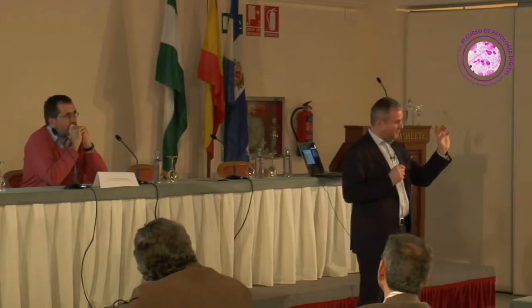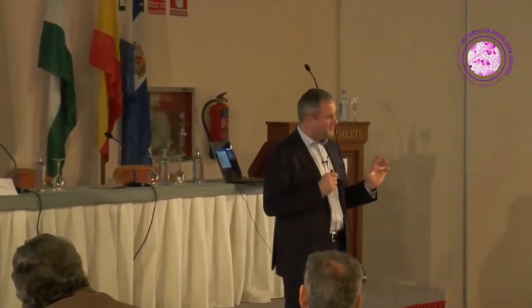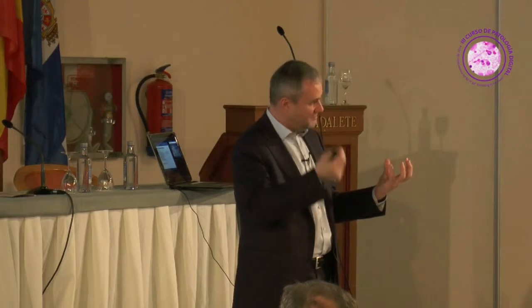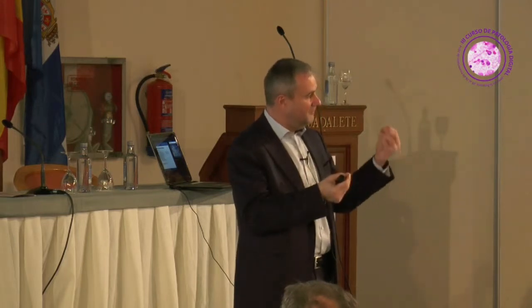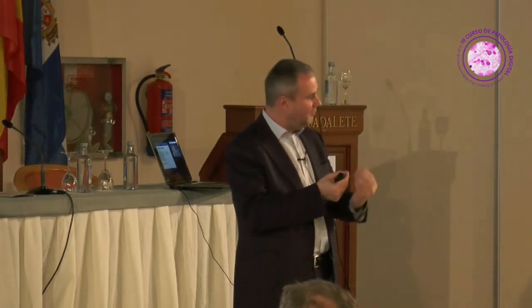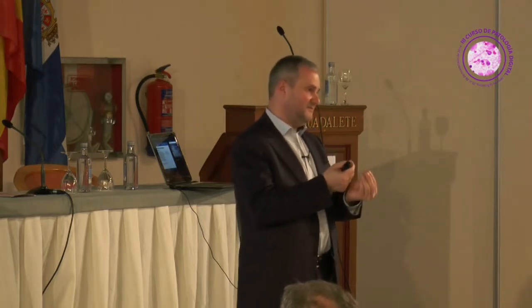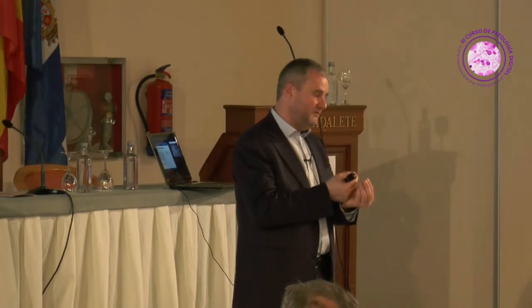What we've done there, and this is no perfect solution, for the hormone receptors, which is really the most difficult, is that you normally have control slides or control sections on your slide. If your control section has the same thickness as your test section, then you can use the positive control to normalize. So that's one approach. To what extent it's really waterproof, I don't know.